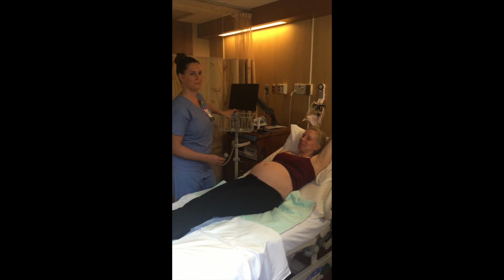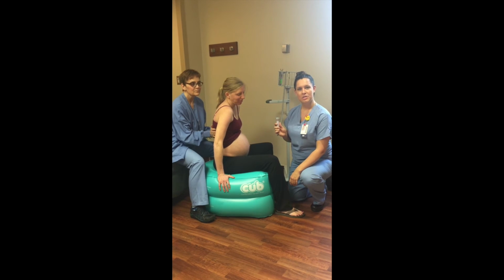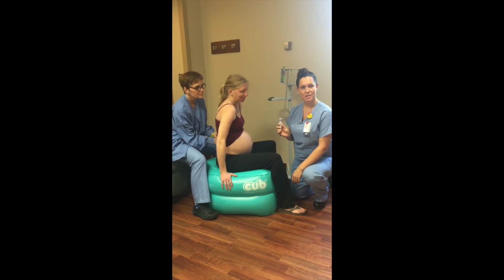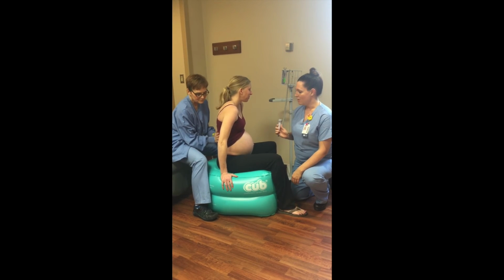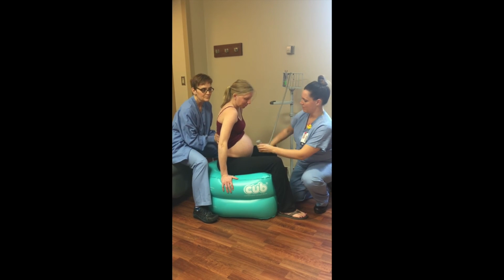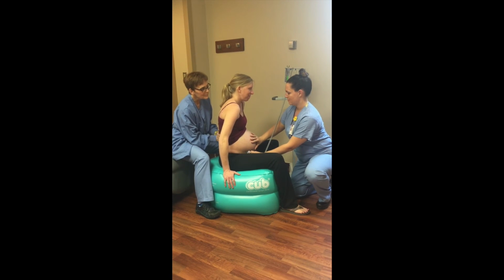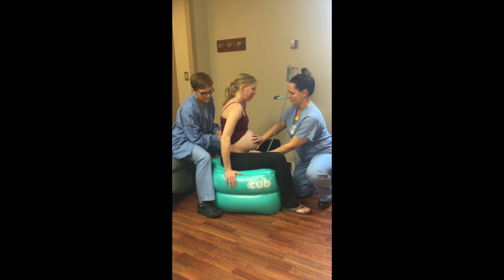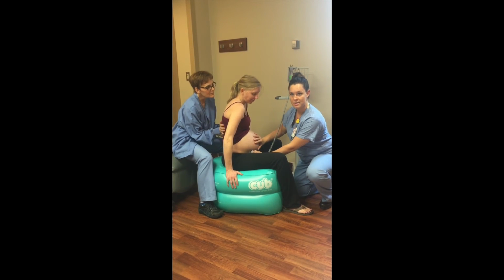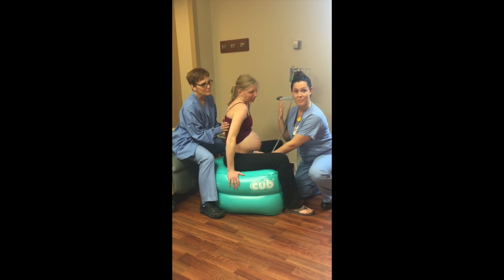You're welcome. All right, so it's been 30 minutes since we last listened to Christy's baby's heart rate. She's been walking the halls and working hard, and now it's time to listen to her baby again since she is in active labor. So when we did Leopold's, we know that the baby's back is on the right side, so we're going to go down here. And now we are going to listen through 2 contractions and 2 resting periods. It's also important to keep in mind that intermittent auscultation is great in all positions.